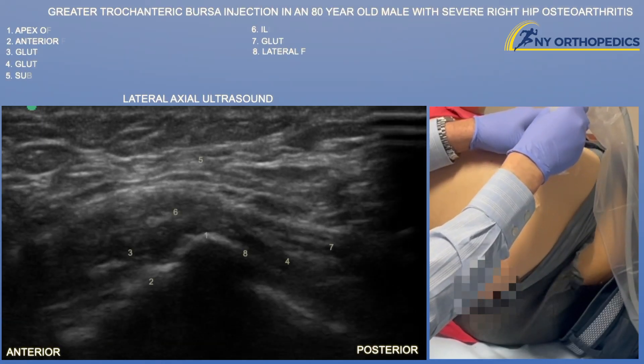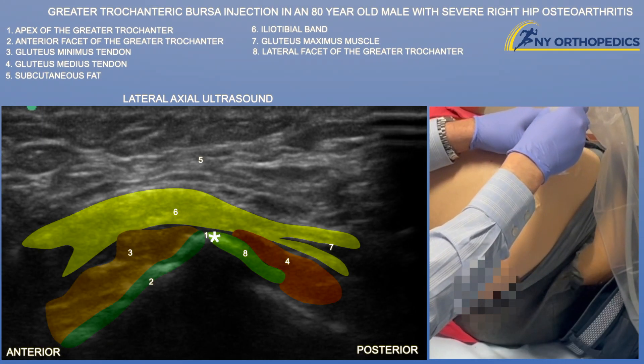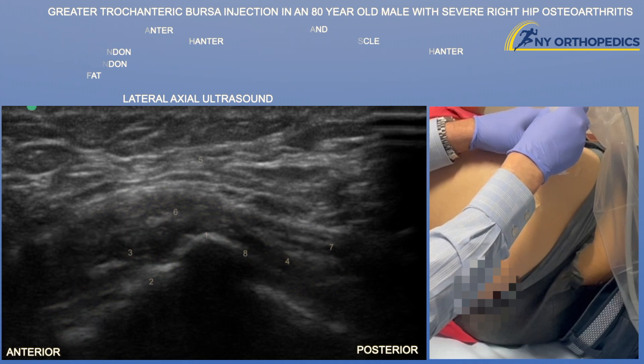Here we're going to go over a greater trochanter bursa injection. We're looking at the apex of the greater trochanter, which is basically your home base to identify the different facets.